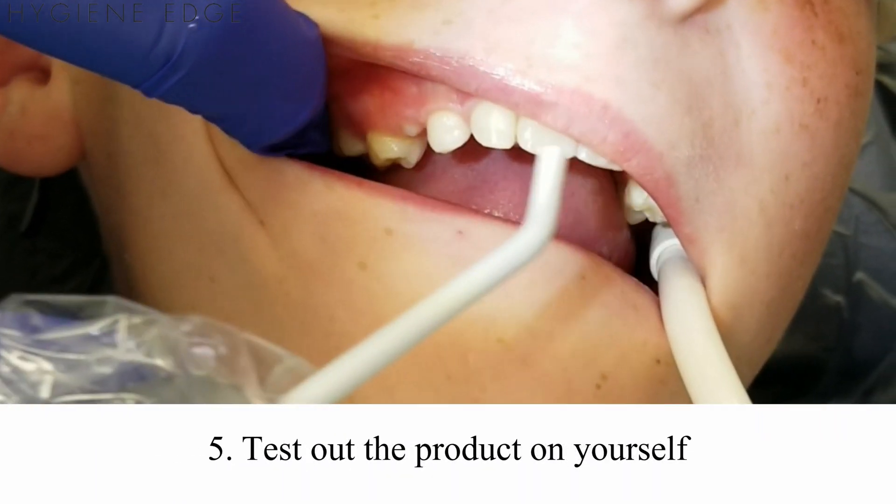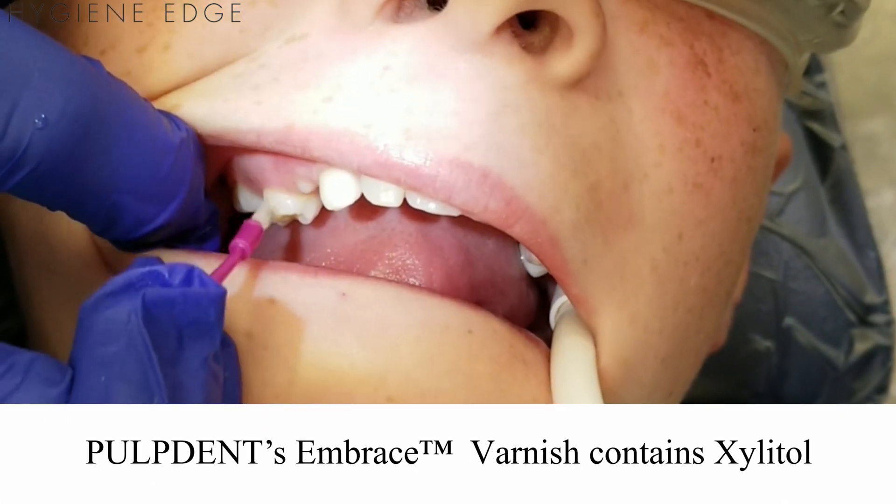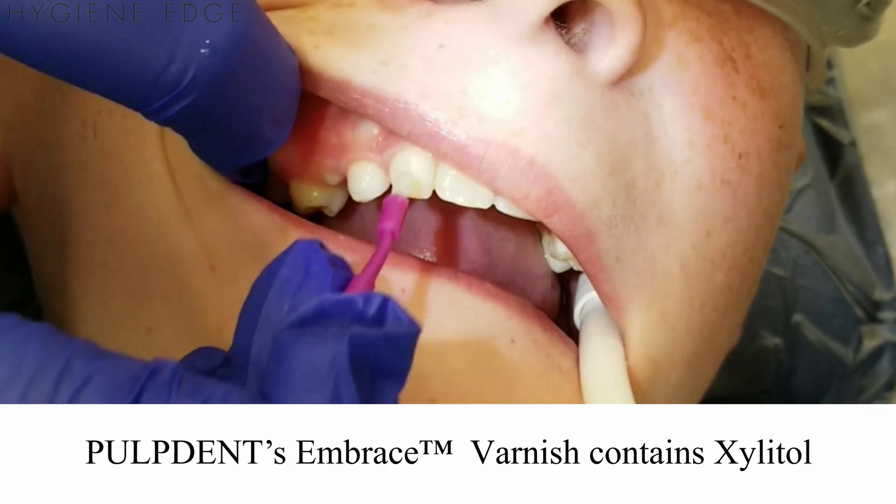Test out the product on yourself. This way you can increase your case acceptance by letting patients know what they will experience. This Pulpdent varnish contains xylitol, making it naturally sweet.